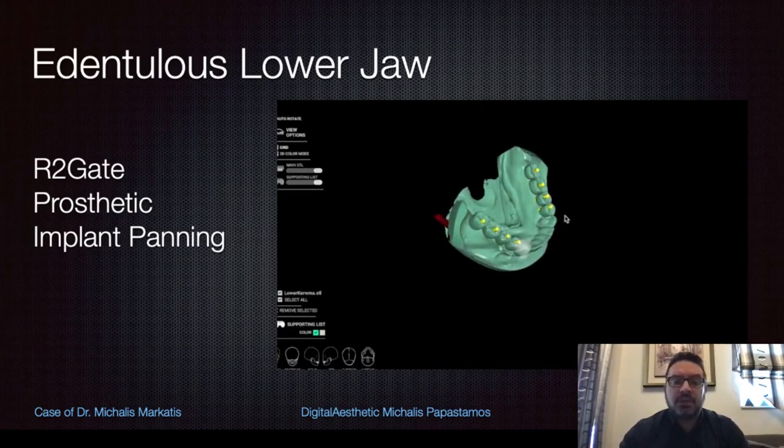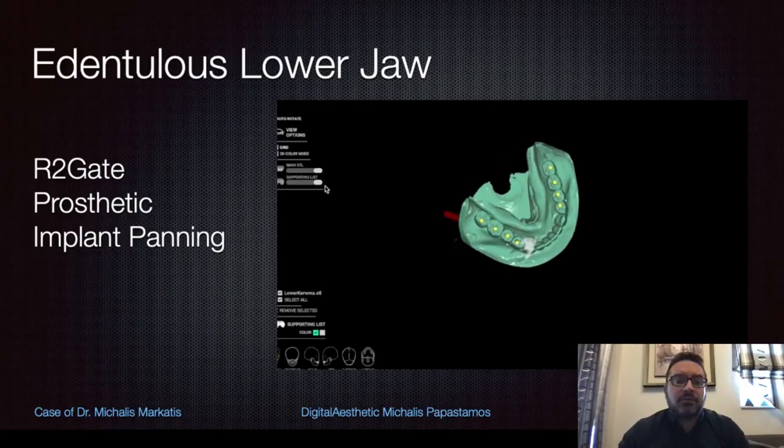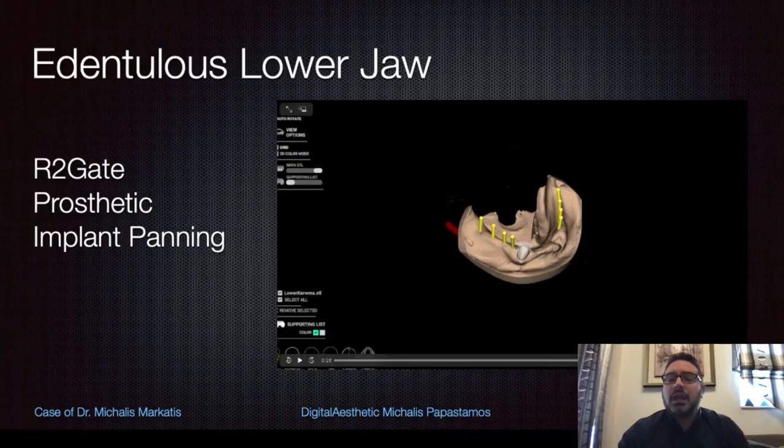They just open their PC and they see the exact image that we have in front of our screen. So they make all the modifications that they want. They change the implant position in their preferred way. They can adjust even the wax-up position if they want, and they just confirm the files, and I get the confirmation files directly to my PC.